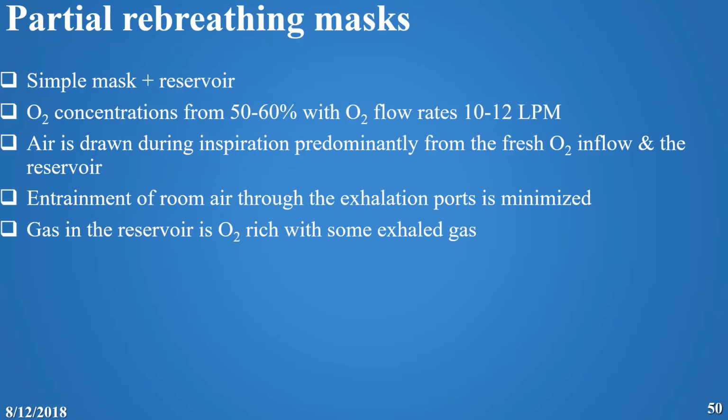And because it has a reservoir, the percentage of oxygen is higher. Remember the simple mask delivers somewhere between 30 to 50 percent, so this delivers a little bit more, 50 to 60. And the flow, remember for the simple mask the flow was somewhere between 6 to 10. Here the flow is 10 to 12.